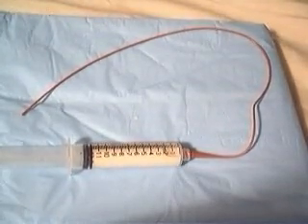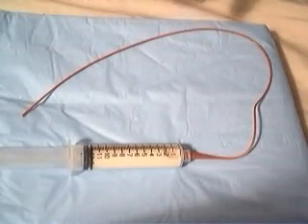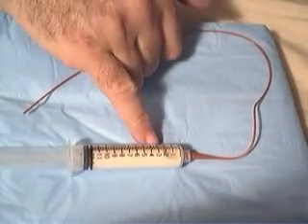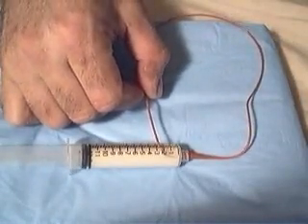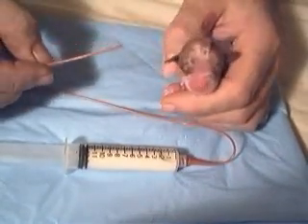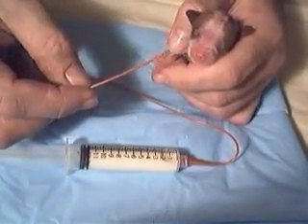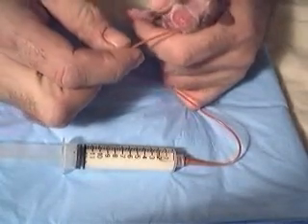Okay, we're going to bring him. So at 2.5 ounces, I'm probably going to give him 2.5 mLs of the solution. This is 1 ml, 2 mLs, about 2.5. So we have the puppy. Trick is to try to hold the puppy firmly. I'm going to insert the tube into the mouth.